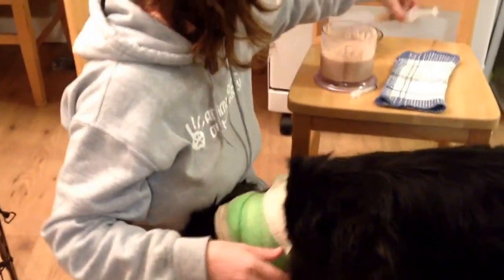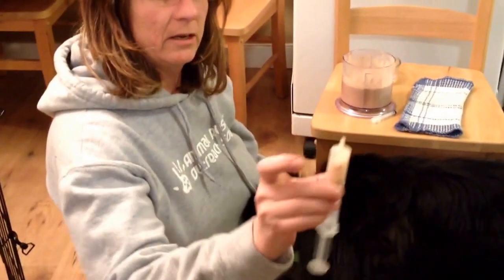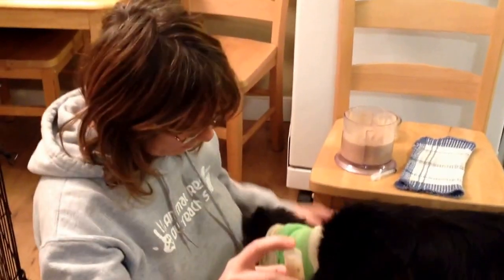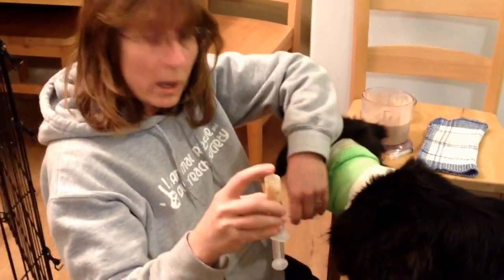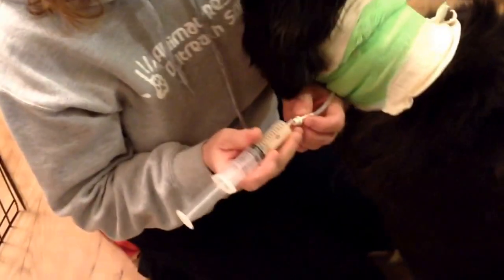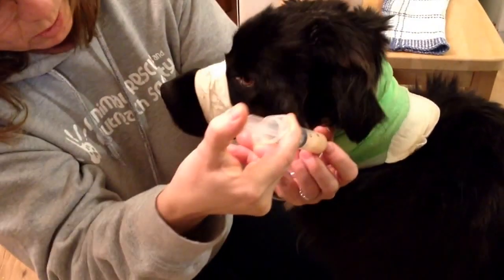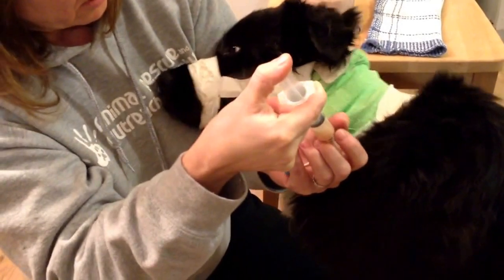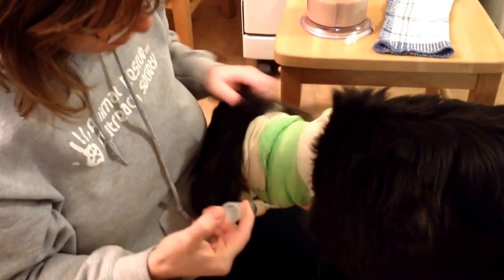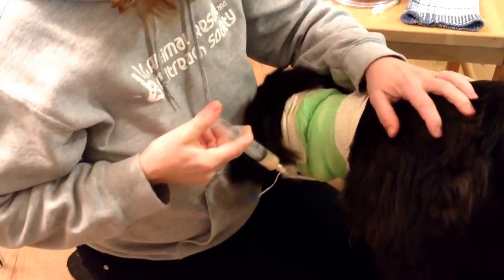Now we've got her medication. This is pills that I've crushed up and mixed with water so that it's a liquid — nothing solid, of course, can go through the tube. It's better if she keeps her head up. Good girl, Domino. And very slowly, just push that in.